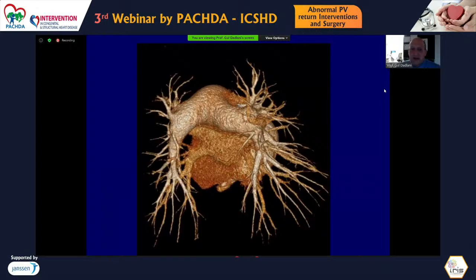So when we look at the lung makeup of someone with pulmonary hypertension, this is an MRI image looking at pulmonary hypertension. You can see the main pulmonary arteries are dilated. The branch pulmonary arteries are very small with limited arborization of those pulmonary arteries, which is commonly what we see as those pulmonary arteries thicken. We lose the arborization pattern with that.